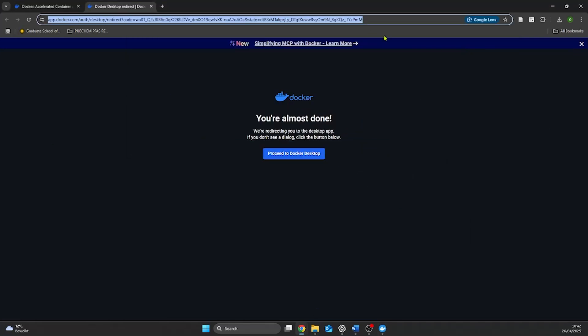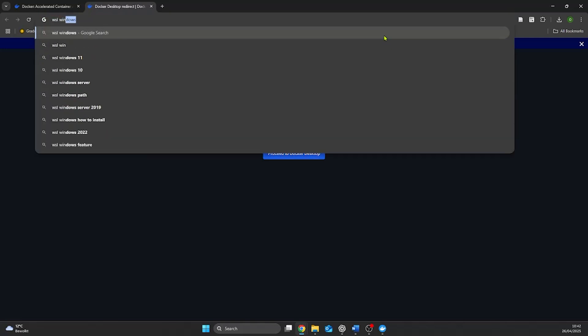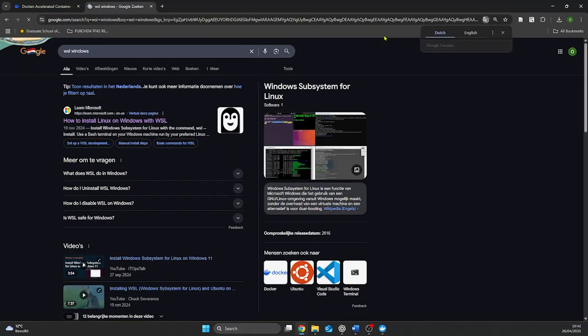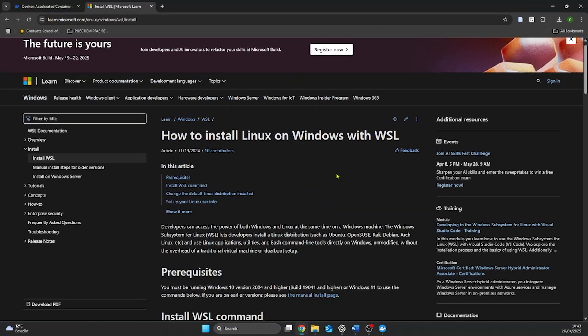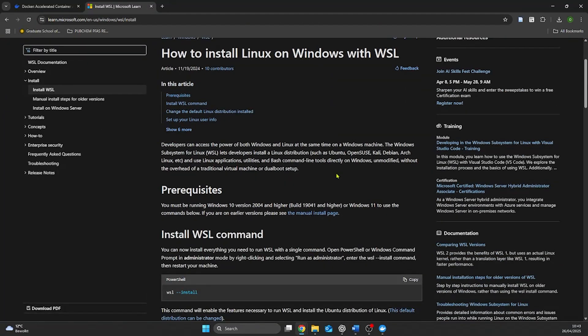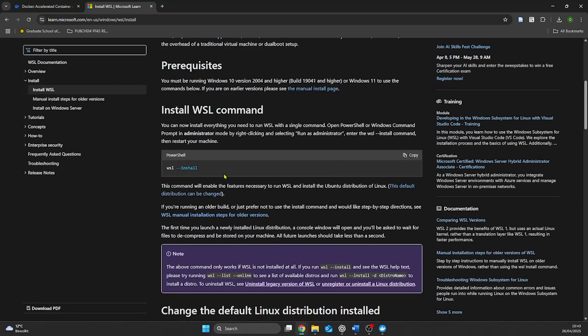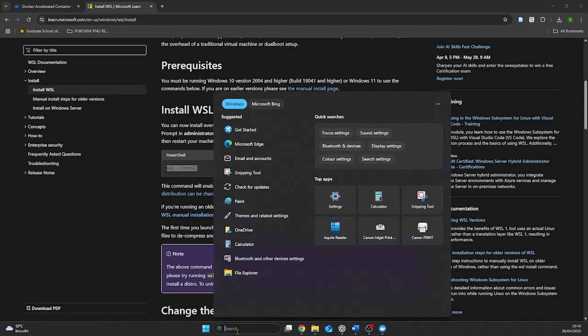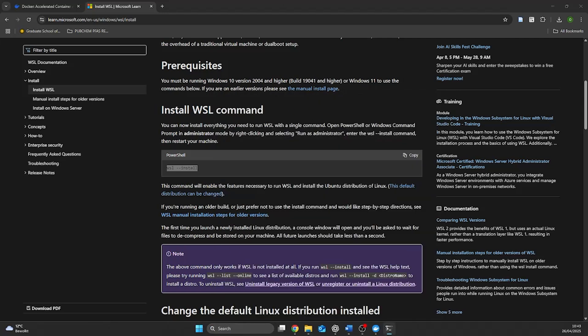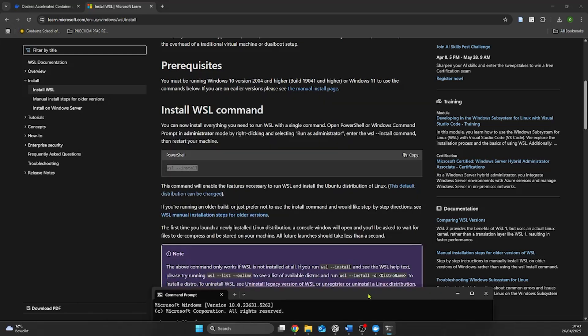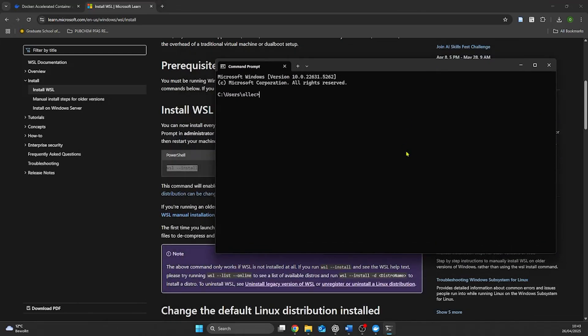Then we install WSL2. To install WSL2 we google WSL install for Windows and we will get to the page of Windows itself how we install WSL. WSL is installed through Command Prompt. So we start Command Prompt and we run the code WSL-install. It will then start installing WSL.